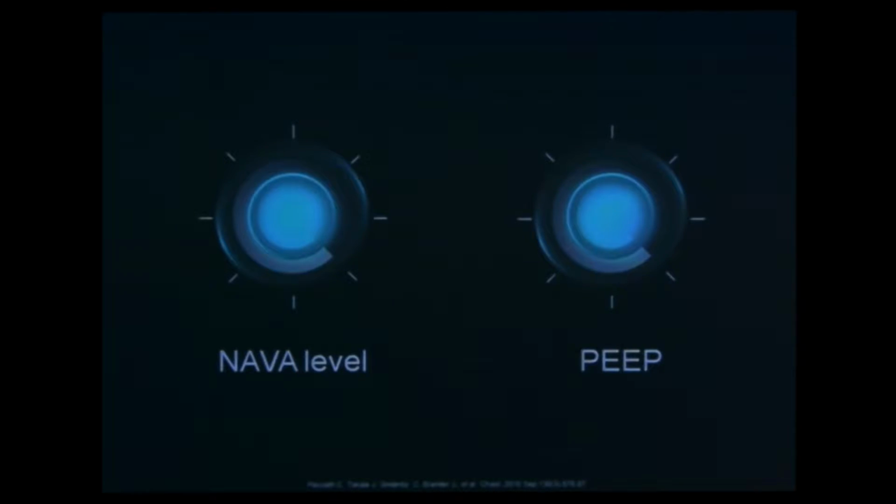We talked a lot about outcome studies yesterday and today. We just thought before we move on to perform outcome studies, we should actually understand the knobs which are available on a NAVA ventilator. We heard a little bit about the NAVA level titration procedure yesterday, and that's definitely something to discuss and to develop further. And what we now try to focus on is the second knob available on the ventilator, the PEEP.